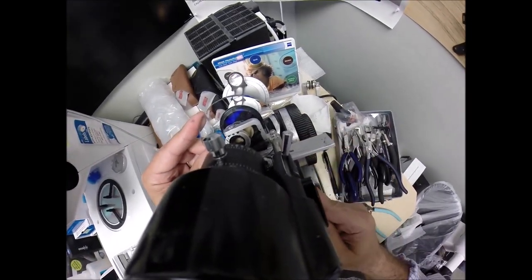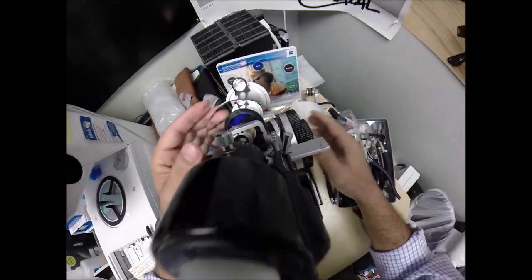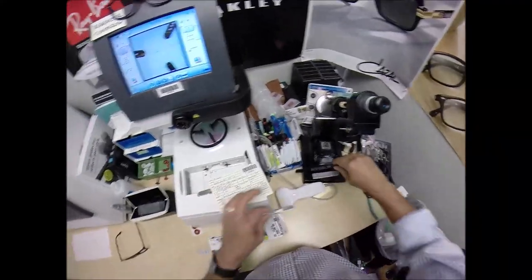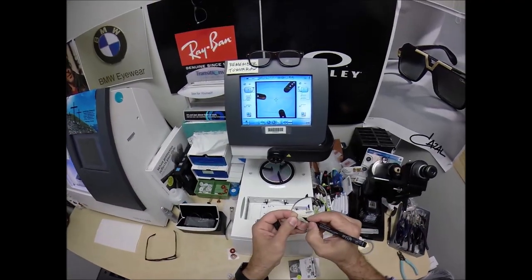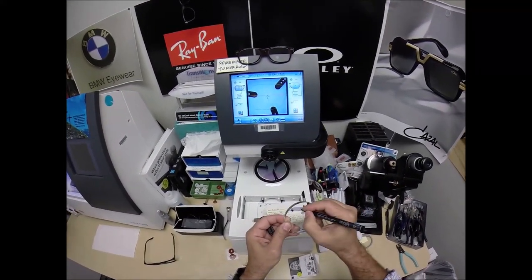That looks good. I'm going to place three dots on your lenses — one, two, and three. That always worked well, and that's the right lens.